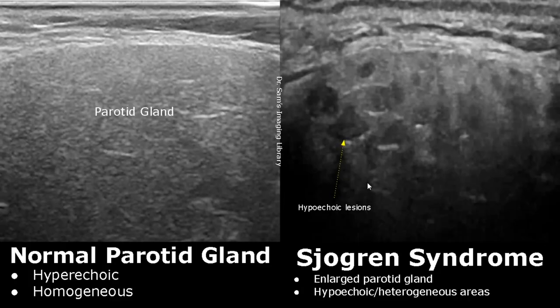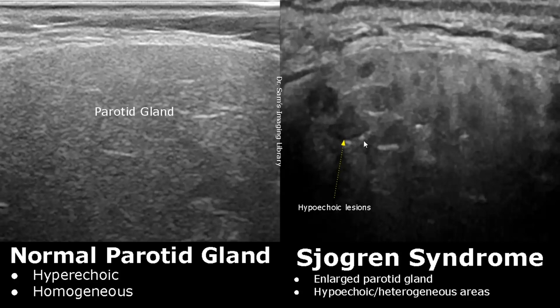Sjogren's syndrome is an autoimmune disorder that affects the salivary glands. This also leads to enlarged salivary glands. In this image, we can see an enlarged parotid gland with hypoechoic and heterogeneous areas.